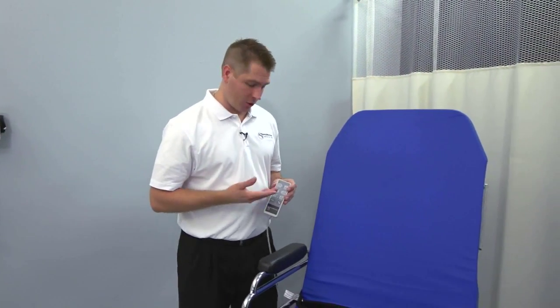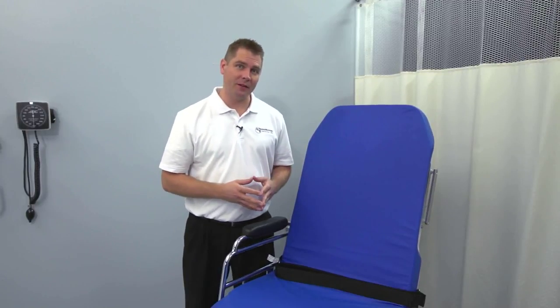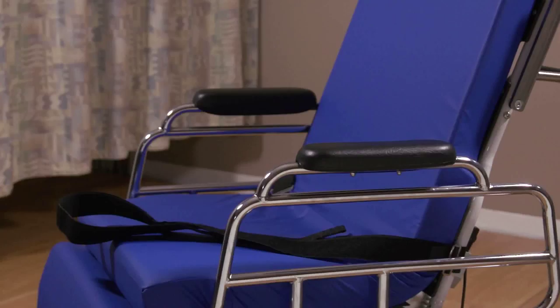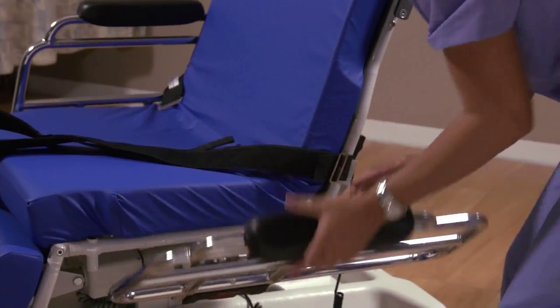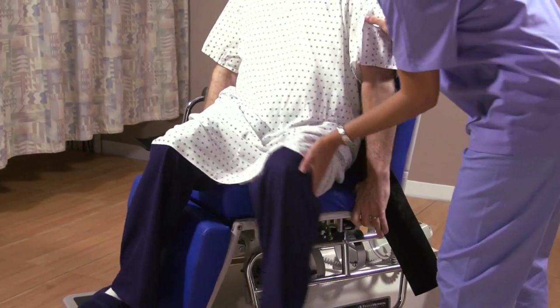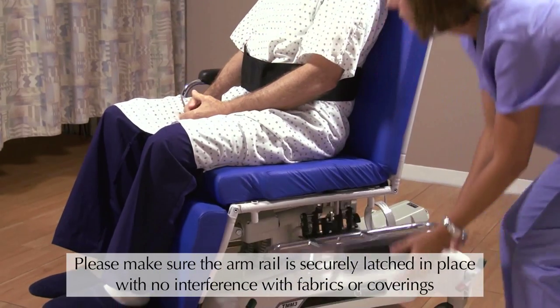Now that you're familiar with the control pendant, let's take a look at how you'll want to take a patient in and out of the chair. For safety's sake, make sure they always enter and exit from the side. First, you'll need to lower the cushion side rails. These rails are designed so that you can operate them easily, but a patient cannot. Lowering the rail requires two actions simultaneously: push the rail in and at the same time pull the red lever out. The rail retracts and locks beneath the seat. Your patient is going to rest on a thick cushion with memory foam, which is extremely comfortable. Once your patient is seated, pull the rail up until it latches in place.